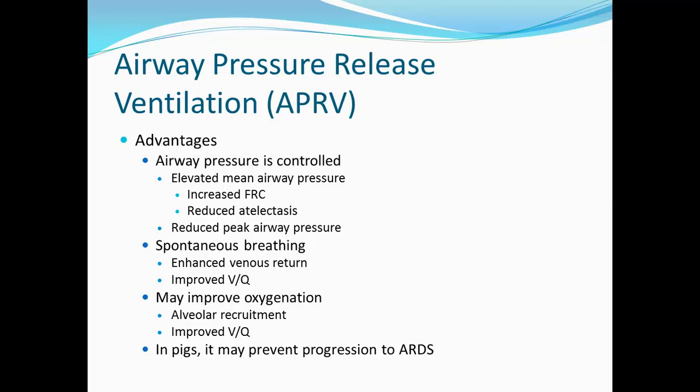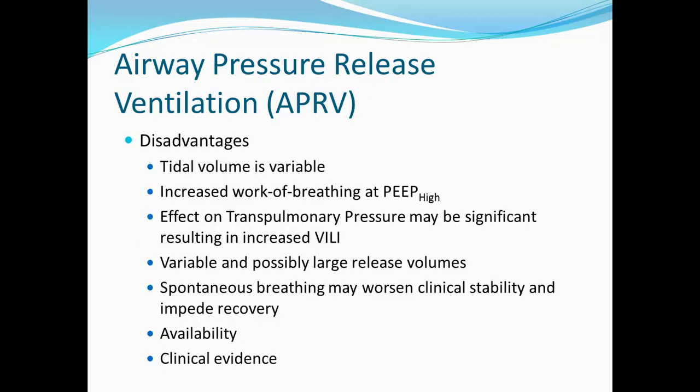In pigs, as I said on the previous slide, it may prevent the progression to ARDS in these reperfusion-induced ARDS pigs. Some of the disadvantages of APRV can be significant.